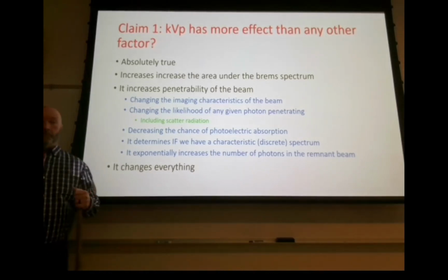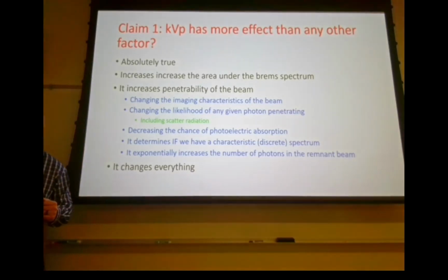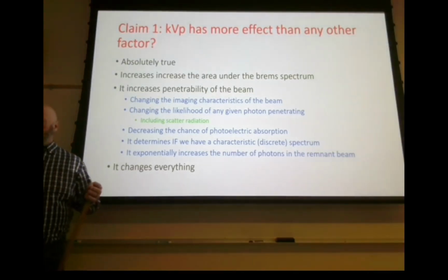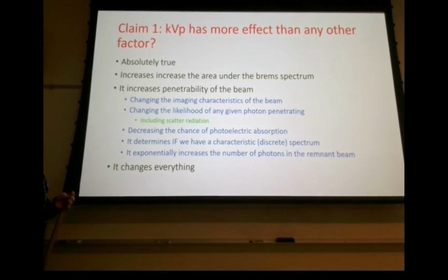It decreases it, right. If you increase kVp, you penetrate more tissue types more similarly. Now muscle and fat are penetrated at the same rate, and bone is even penetrated more similarly, but you can still differentiate it.